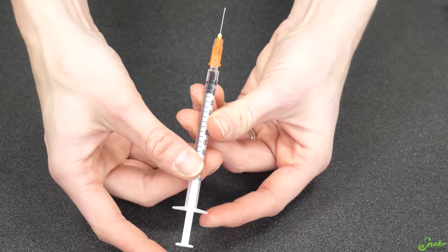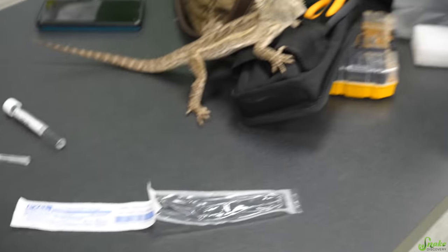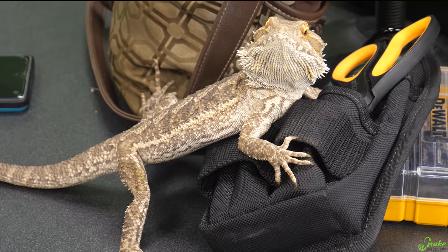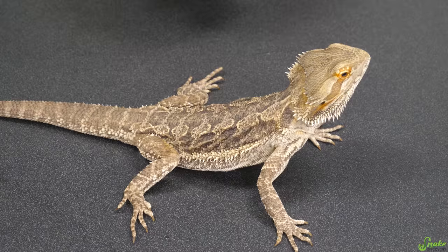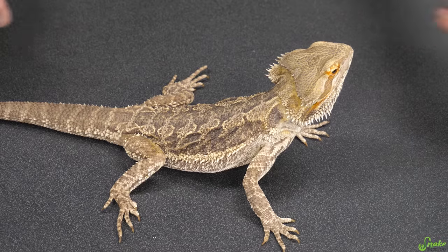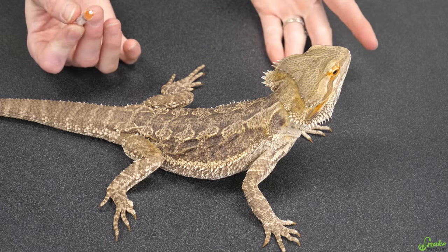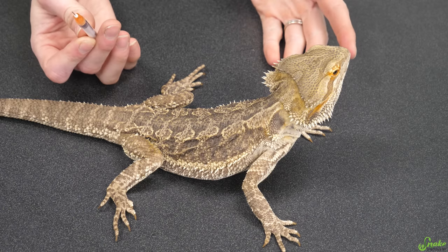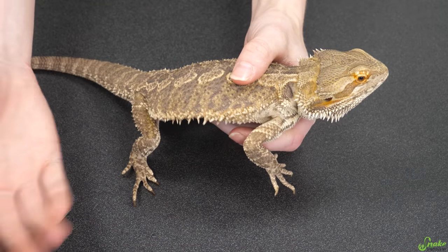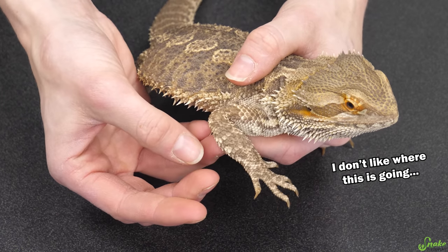Now that you have your injection ready, let's talk about how to administer it into a reptile. We'll start with lizards. This is Jazz, one of our surrendered bearded dragons who is part of our adoption program, so he's actually up for adoption, and he's going to be our model today on how to give injections. Typically they don't like it, and that's why this is often a two-person job — one person to hold the bearded dragon and hold out that leg, whereas the second person can actually do the injection part.